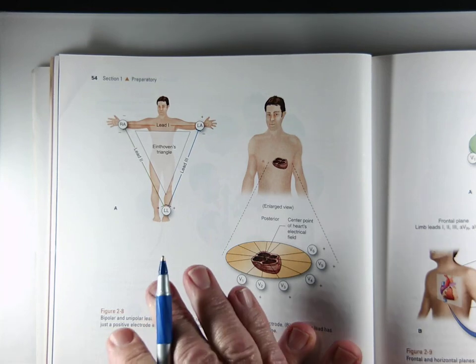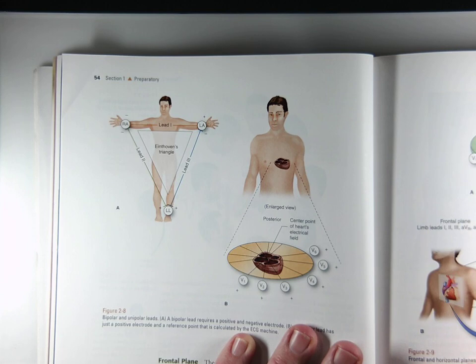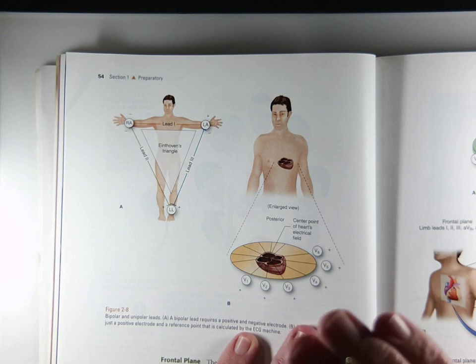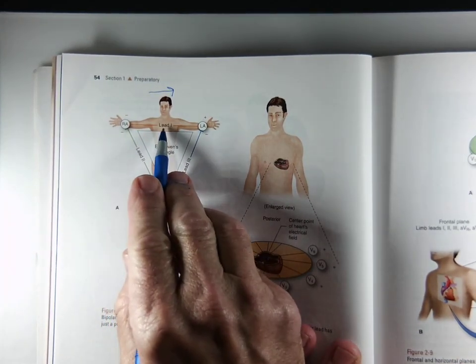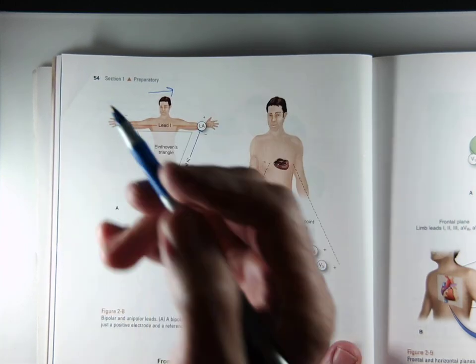It means electricity going to a positive electrode is going to give you an upward deflection on your EKG. The baseline is just arbitrary. So when you have the bulk of the electricity, or those action potentials all added up, going towards the lead, it's going to give you an upward deflection. When it goes away from the lead towards the negative, it's going to give you a negative. So if most of the axis is heading this way, toward lead 1, you're going to get a positive deflection. If the electricity was going the opposite way, it would be negative.